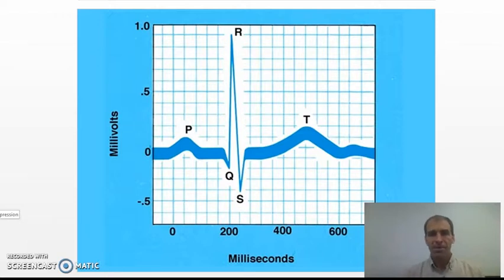So one big thing we're always concerned about is the actual muscle itself, the heart muscle itself, is it getting enough oxygen? Is it getting enough perfusion so that the muscle has oxygen so it can contract? We can go through metabolism and why that's important, but oxygen, ATP, I think we get that. When that doesn't occur, we call it ischemia, and that's when the tissue is not getting enough oxygen. And what's neat about the EKG is actually that ischemia will cause changes in the EKG. So instead of having to put a sensor in someone's heart, which is really hard, we can actually just look at the EKG.